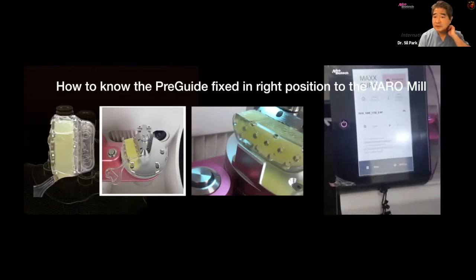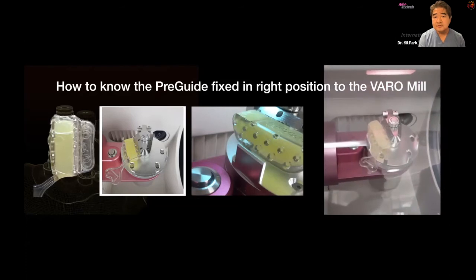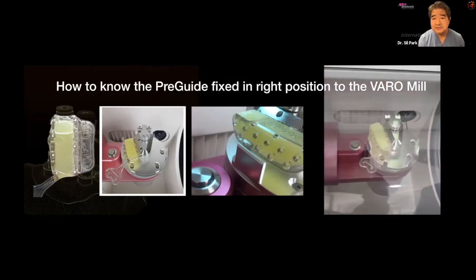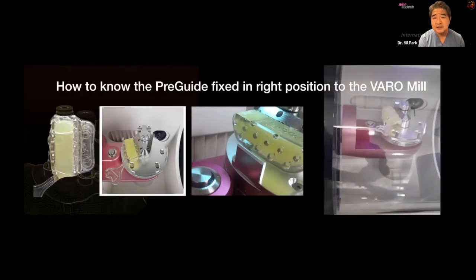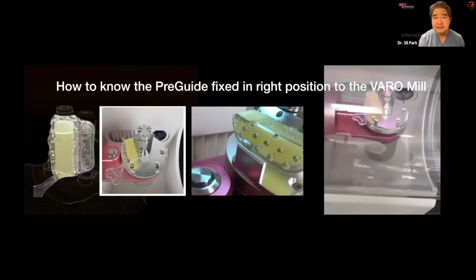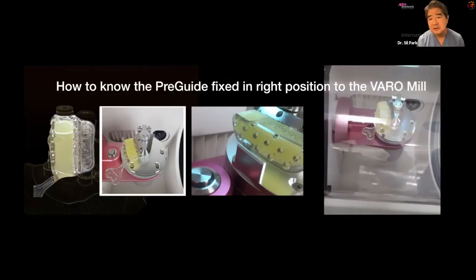So once the uploading is done, you can simply press start. Once you press the start button, the machine itself automatically self-calibrates first, and then it begins milling. So this procedure is self-calibrating.